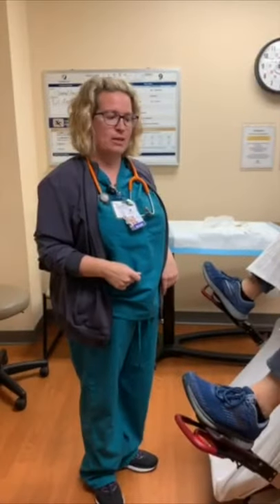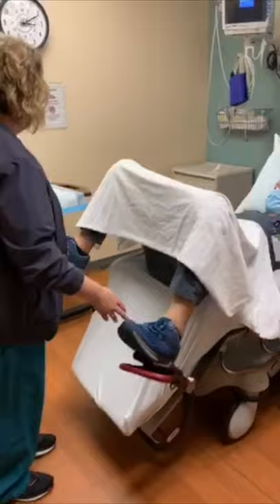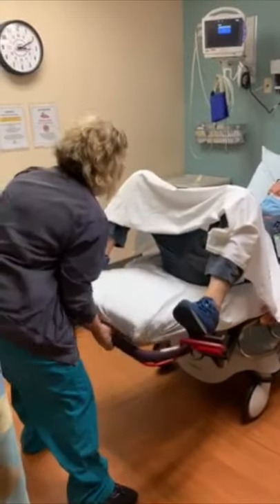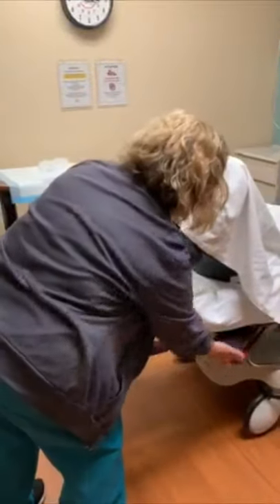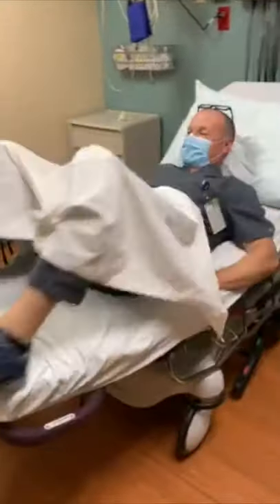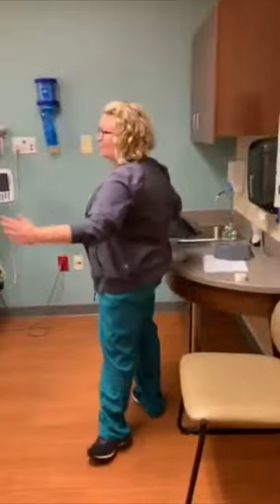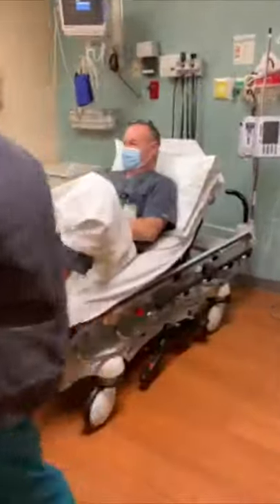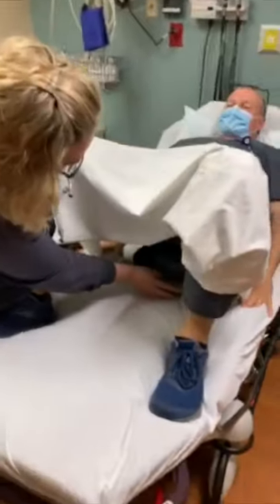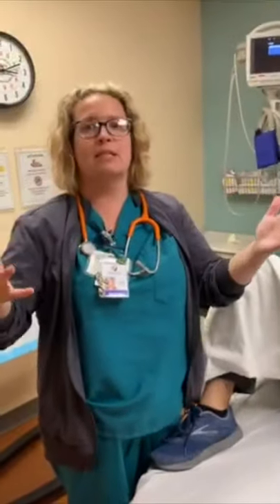If for some reason you don't have a gyne bed — sometimes we're busy with them — you can use a bedpan. You can collapse the stirrups like so, pulling this up and putting that back. Sometimes if you don't have a gyne bed, you can use a large bedpan and flip it upside down. Have them hop up, lift their butt, and scoot down the best they can — it manipulates just like you were on a gyne bed.